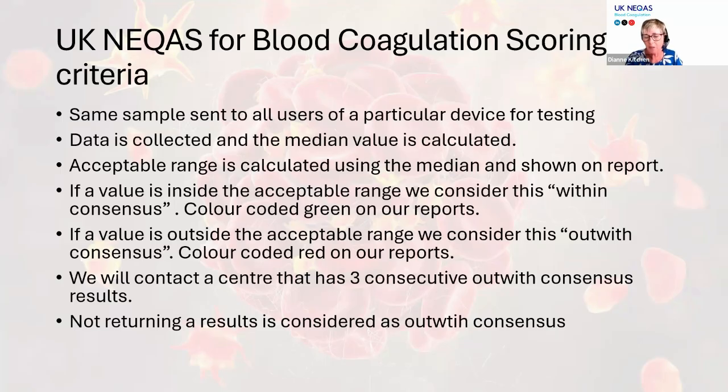We try to make things very simplified because a lot of our point of care users aren't familiar with the lab methodology and the lab terminology, so we try to just use simple language. We contact any centres that are out with consensus 3 times consecutively to ask if they need any help, support, or help with investigation. And if you don't do the test, it's the same as being out with consensus.